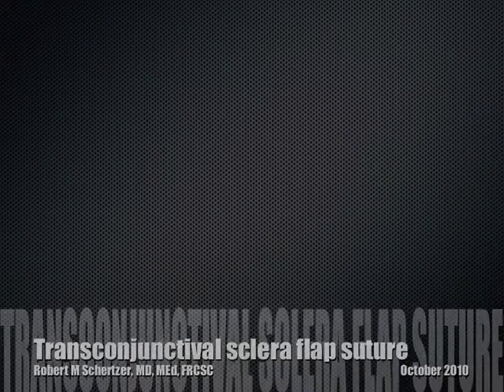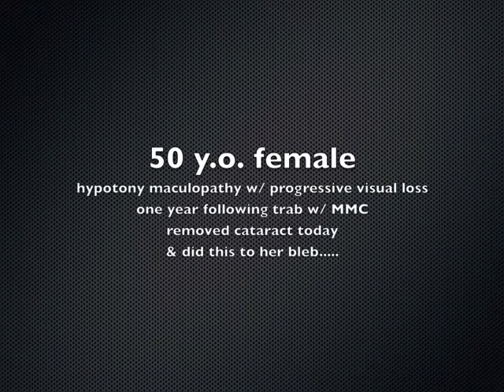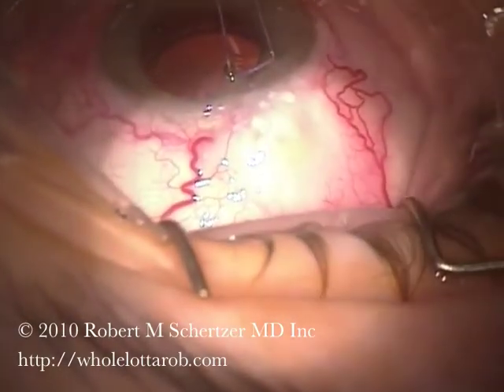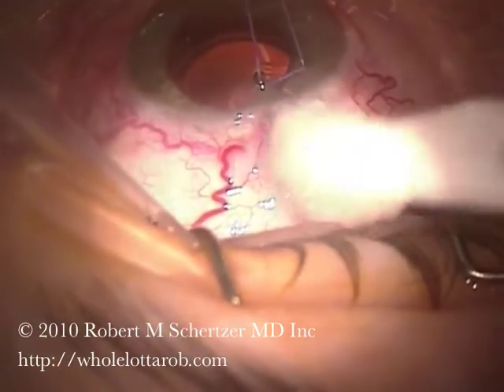This patient presented one year following a trabeculectomy with mitomycin, with hypotony that was getting progressively worse along with a progressive cataract. So after performing cataract surgery, it was then time to do something about the overfiltration.